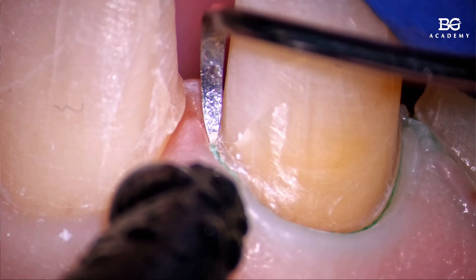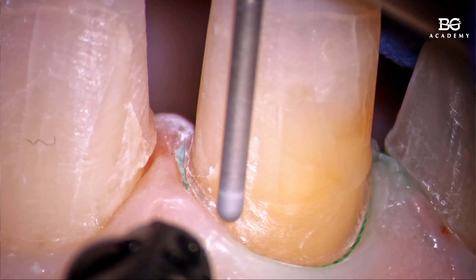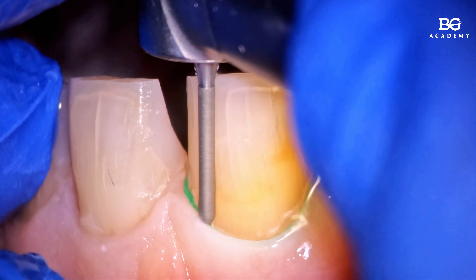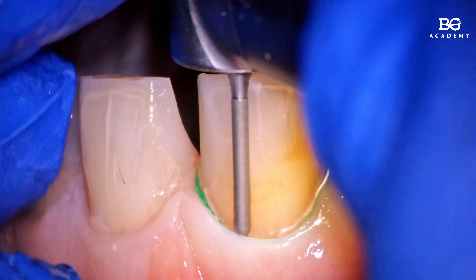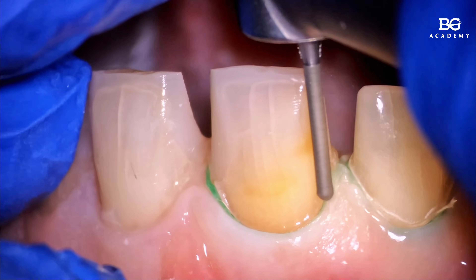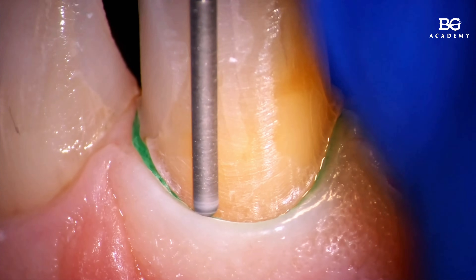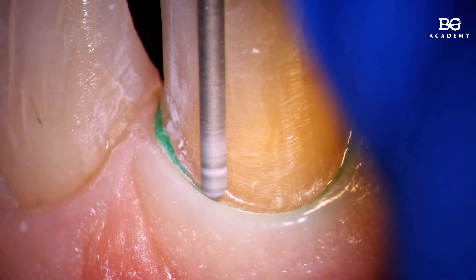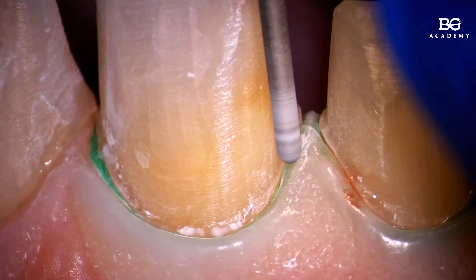The tip of this episode is the utilization of fluorescent light. If you have a fluorescent filter on your microscope, that's perfect. If you don't, you can use a fluorescent lighter available on AliExpress, or some light curing units — curing lamps — with a UV light function. This UV light highlights fluorescent composite, and you can use it for preparation or carious excavation to remove old restorations. It's a really practical trick.